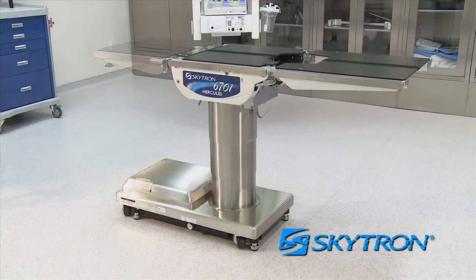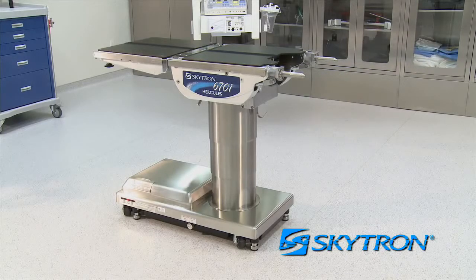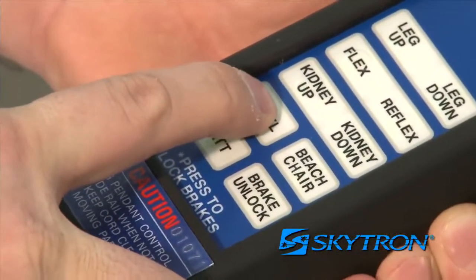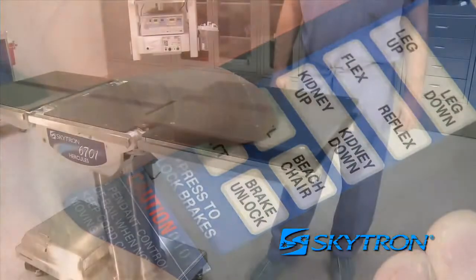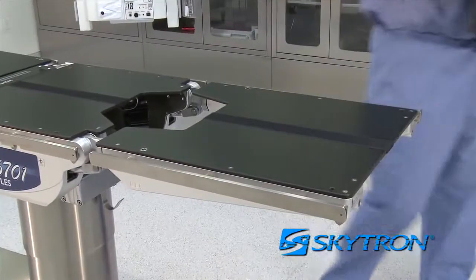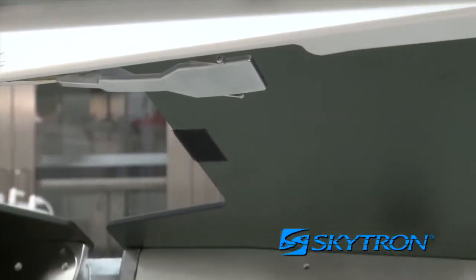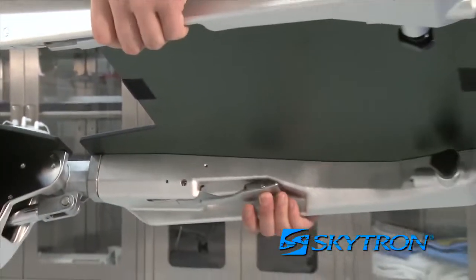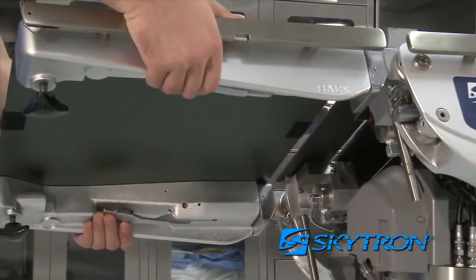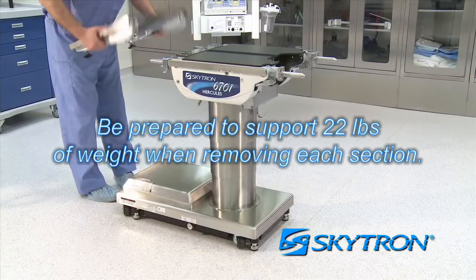Both back and leg sections on the 6700 series table are removable as clinical situations dictate. Position the table at waist height and make sure it is level before attempting to remove a section. Also, remove any x-ray tops if present on the table. To remove the back or leg section, locate the release levers under the desired section and depress upward while pulling the section off the pins. Be prepared to support 22 pounds of weight when removing each section.